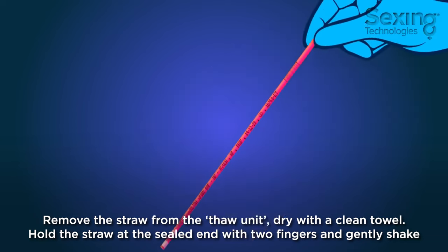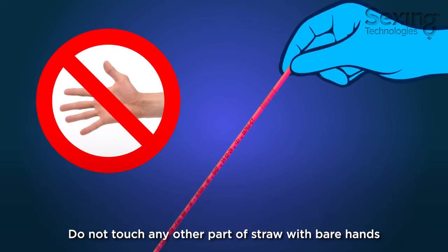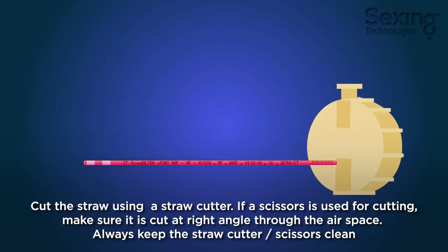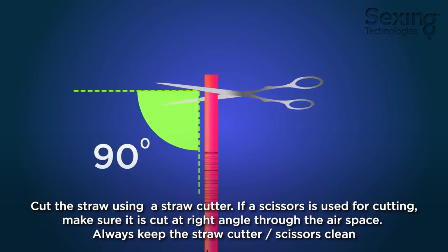Hold the straw at the sealed end with two fingers and gently shake. Do not touch any other part of the straw with bare hands. Cut the straw using a straw cutter. If using scissors to cut the straw, make sure the cut is at a right angle through the airspace.